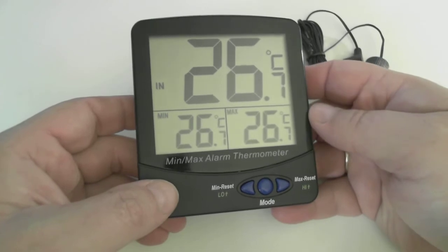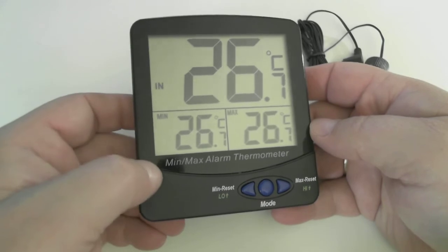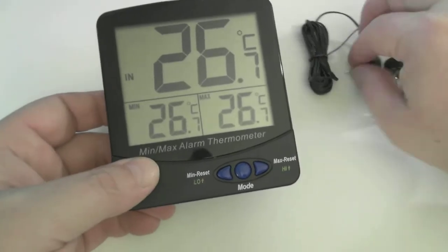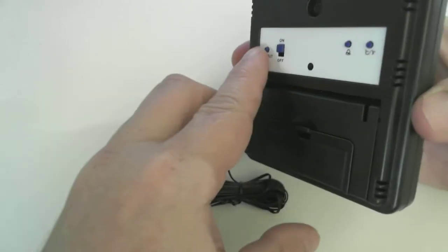That shows the current temperature and the min-max recorded temperatures. Currently, it's showing that we're measuring temperatures from the internal sensor. But if you want to use the external sensor, plug in your probe and hit your in-out button.